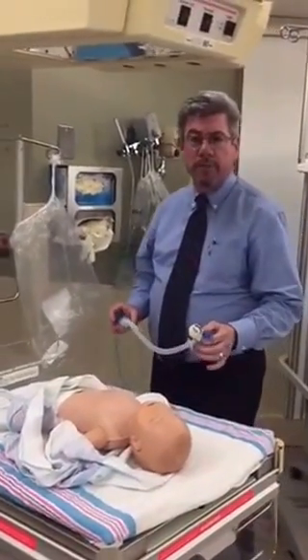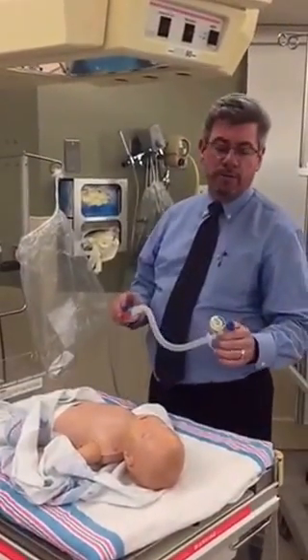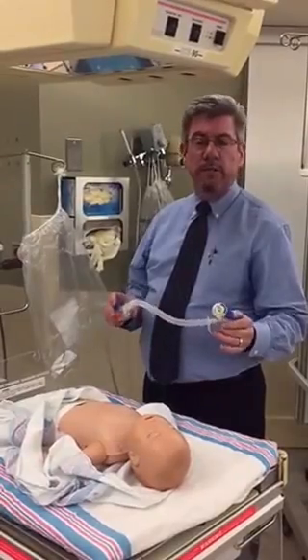Good evening. My name is John Lavin. I'm going to be introducing the Mercury Medicals Neo T today. It is a T-piece resuscitator that's completely disposable.